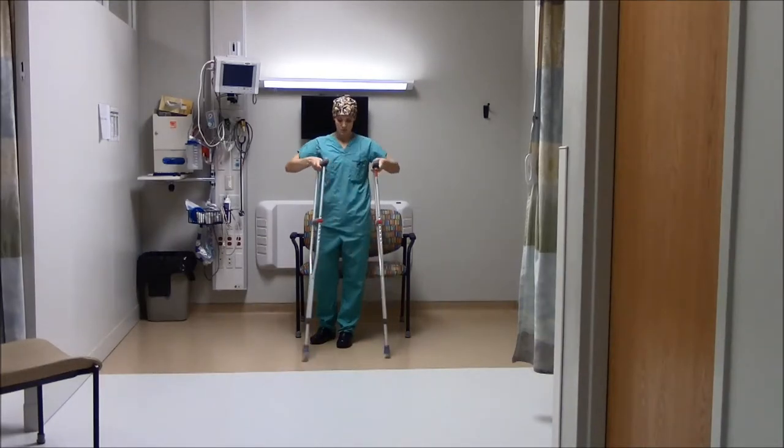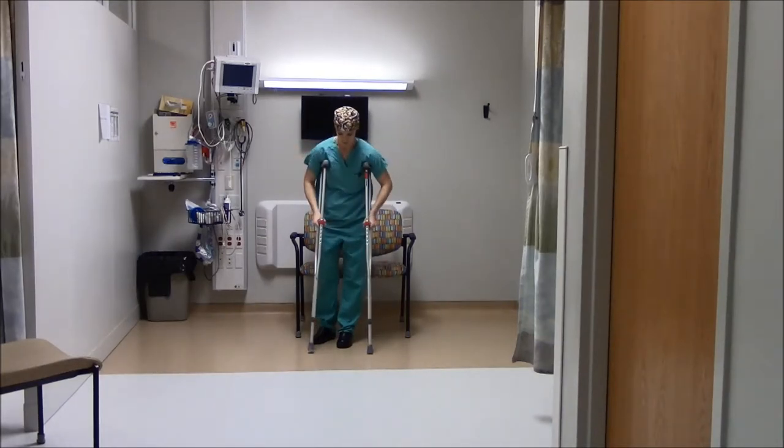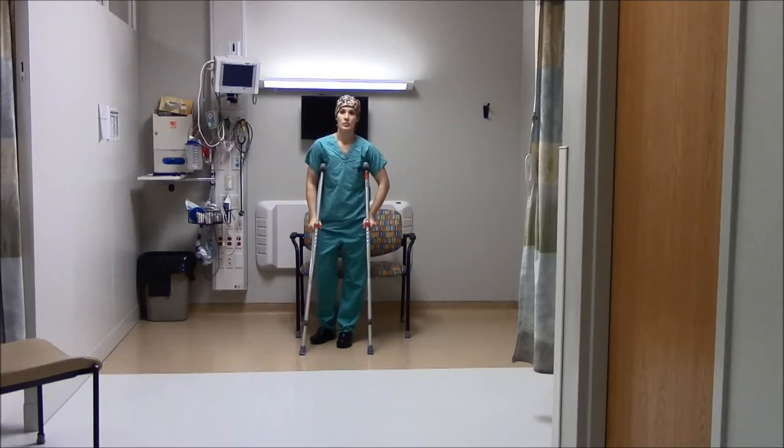To walk with crutches, put your crutches under your arms and press them against your body. Make sure to bear your weight on your hands, not your underarms.